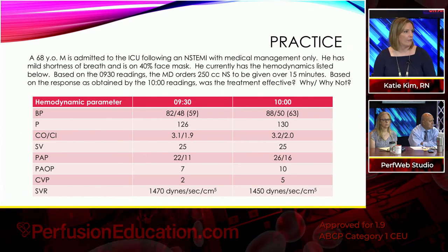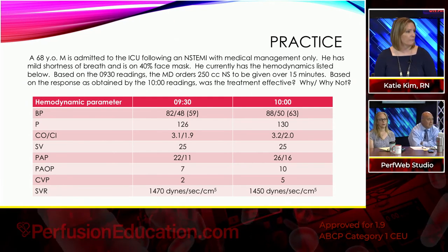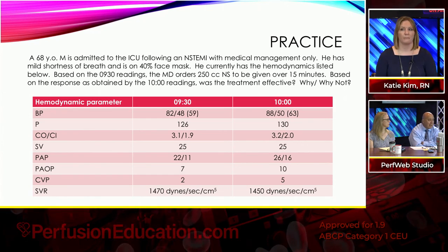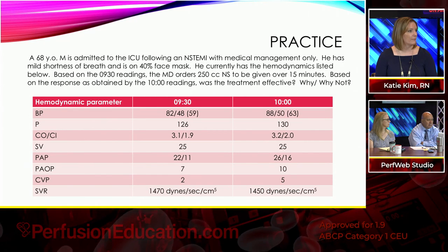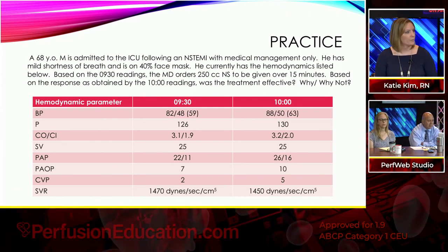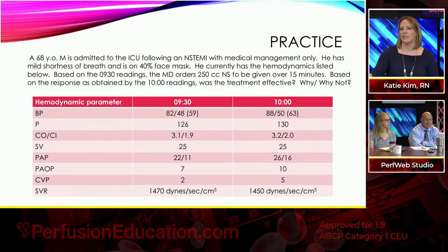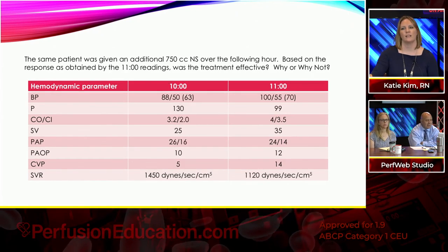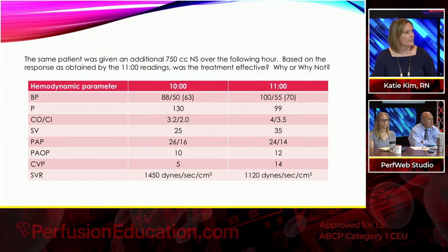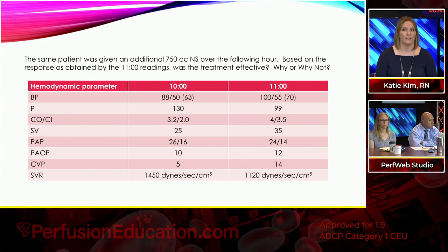Now, would you say for this patient that was adequate for him? I would say the treatment was inadequate, but the response was positive. Was positive, right? And I would say that 250 was... He needs more volume. Exactly. So that's exactly what the doc decides next. So we're going to give another 750 cc's over an hour, and based off of the response at the 11 o'clock readings, was it effective?